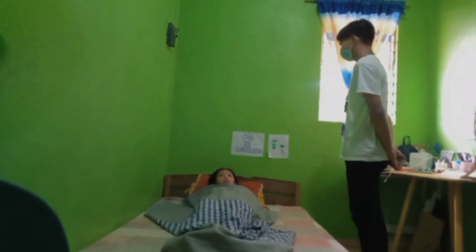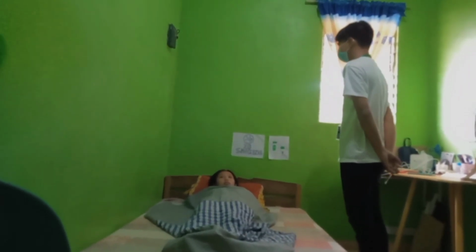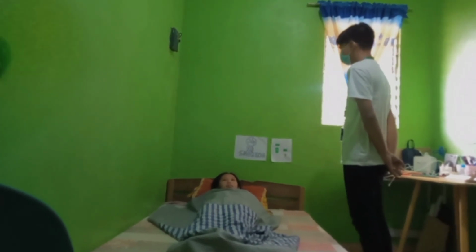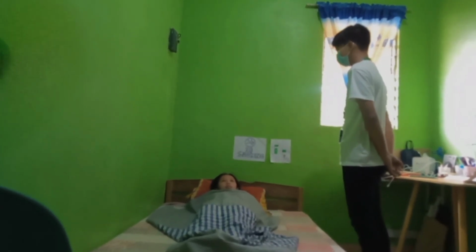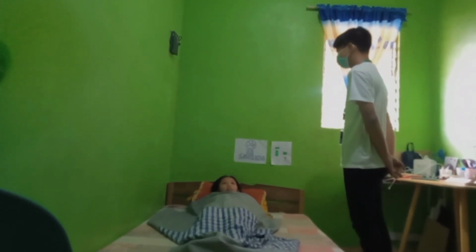Good day, Miss. I'm Malakis Lobaton, your student nurse for today. You are Rio Eliza Elizario, right? Yes. Today, I'll be providing your supplemental oxygenation. This oxygen is for your dyspnea or discomfort.